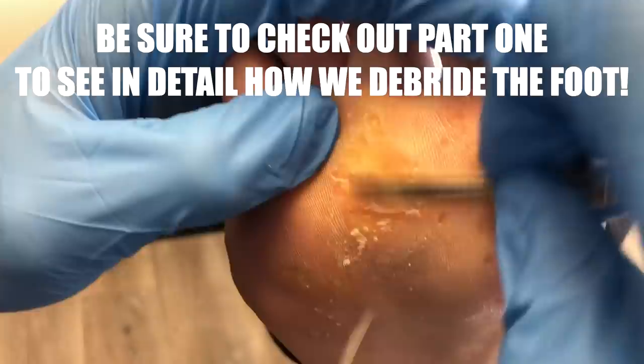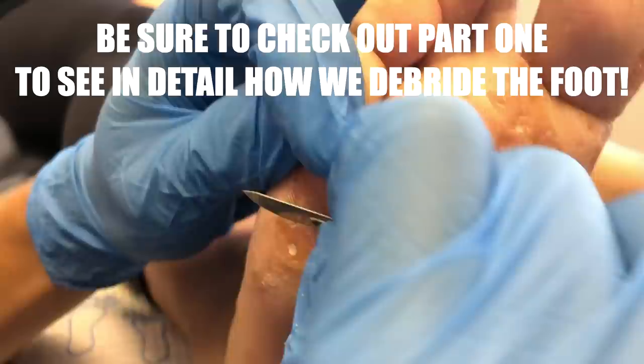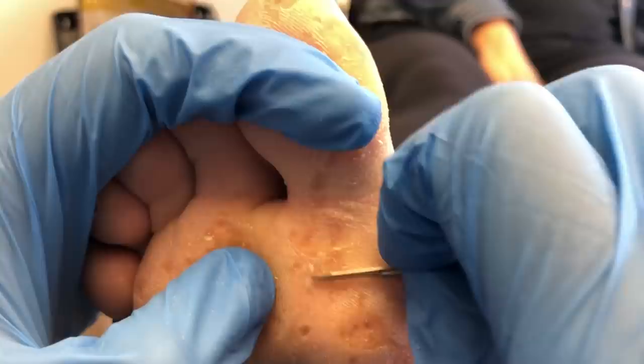I want to show you how we fine-tune the treatment to take off as much pressure as possible using the 15 blade, the Moore's disc, and the Dremel bit — just to make sure we can get the corns out. Working on the right foot now, you can see just how much irritation this may cause the patient and how many corns are present. I'd say there are about 50 on the left and 50 on the right.